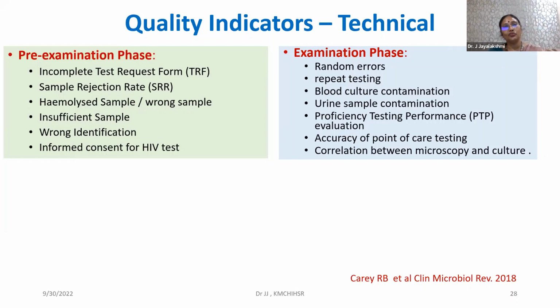in the pre-analytical or pre-examination variables. They've looked at the sampling in the whole of a laboratory. In the entire lab, a lot of samples will be received for biochemical tests, and pathology labs would also receive samples, blood samples, serum samples, plasma samples, and also the microbiology lab samples. Hemolyzed samples are supposed to be one of the top scorers in the errors in the pre-analytical phase.